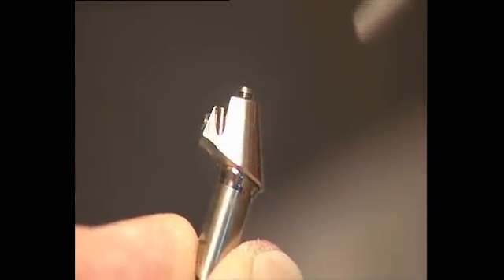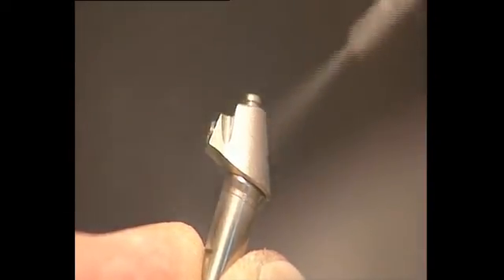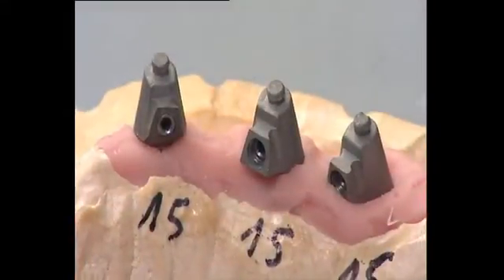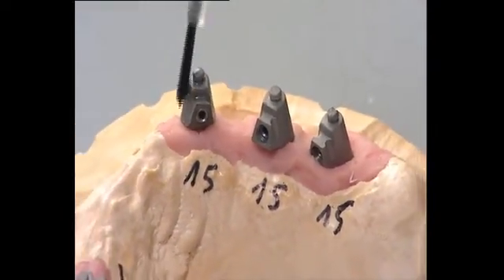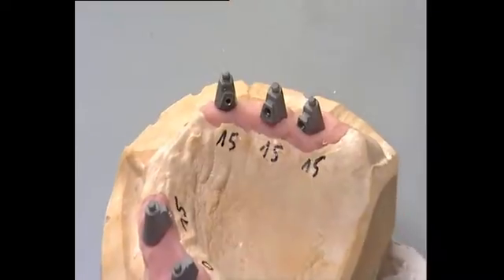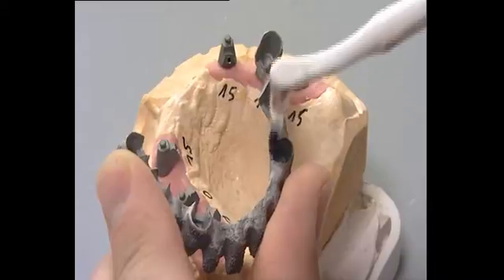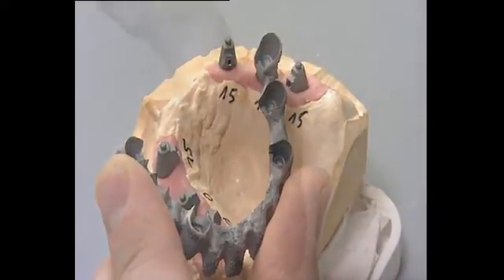The UV-E titanium copings are sandblasted with 110 micron aluminum oxide. Primer is then applied to the titanium copings and framework.